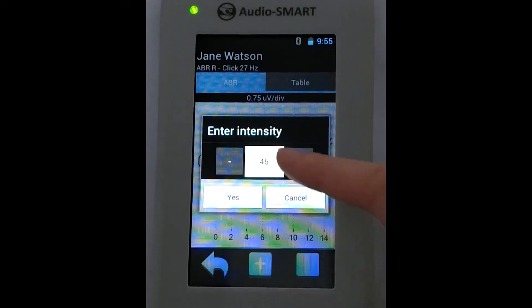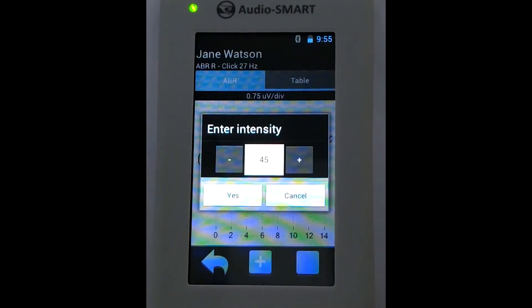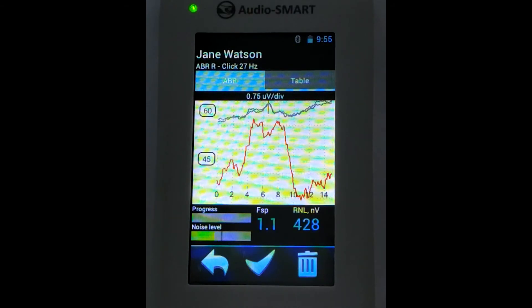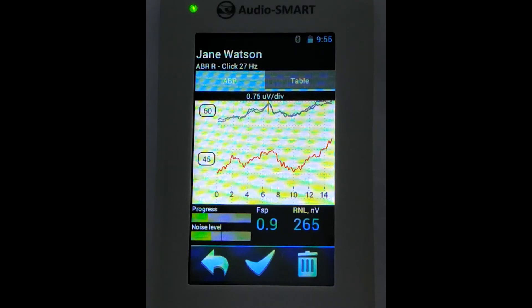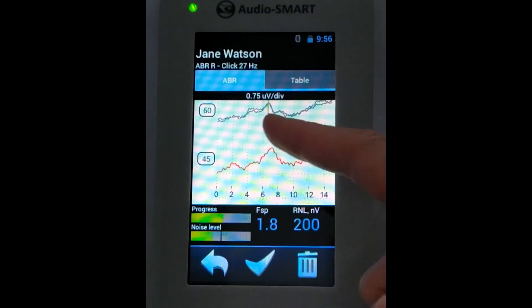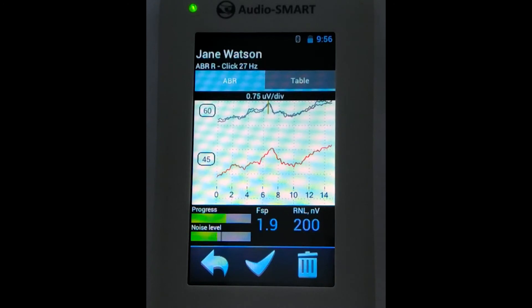Now we can perform registration at a lower intensity — for example, at 45 decibels, going to the threshold level. We can see how the latency of the 5th peak is going — the latency becomes longer at the lower intensity level, which is a normal situation. We will see the morphology with something suspicious on the 5th peak, but we need to perform a 2nd stimulation cycle to estimate the reproducibility of the response.